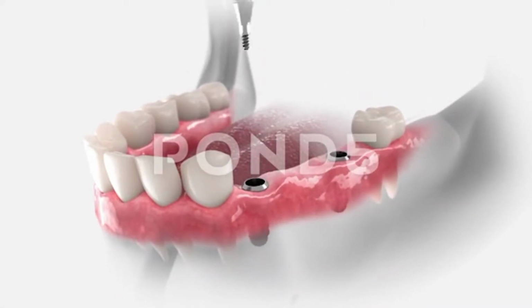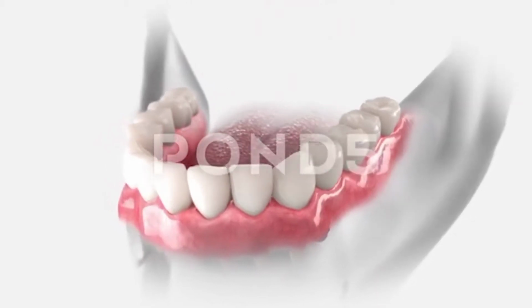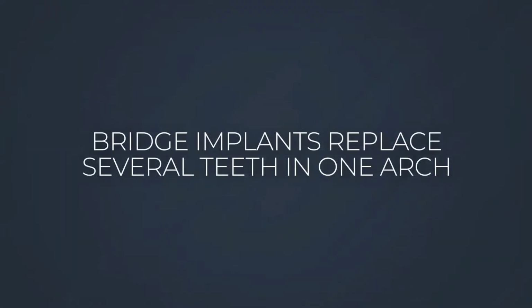And then we are able to create, instead of one crown, a bridge. This is similar to a traditional bridge, but it is attached on top of your 2 implants. But essentially you're getting 3 or more teeth supported by 2 individual implants. So this is your solution if you're missing more than one tooth in one arch.